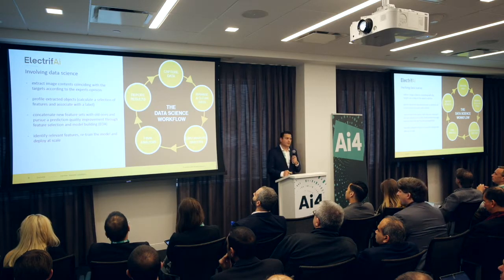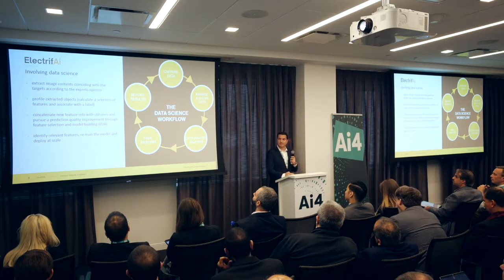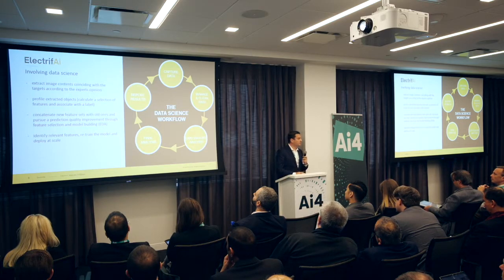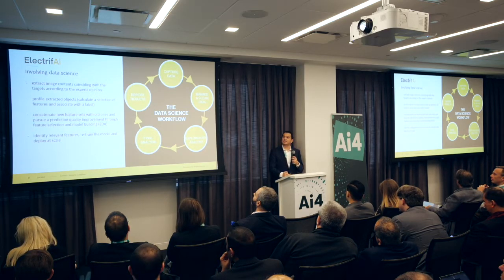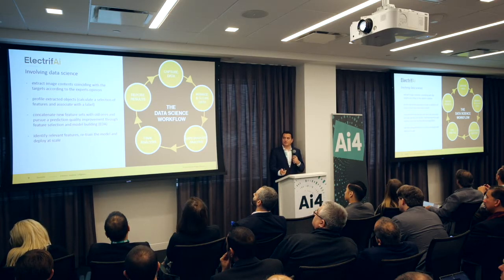So, as you extract more and more features out of these images, you want to put them back together with the original data you had and see, if you train a network using the combination of all those, whether that gives you an ability to improve performance in your workflow or not. This is the EDA. And eventually, once we identify the relevant features, retrain the model and deploy it at scale.